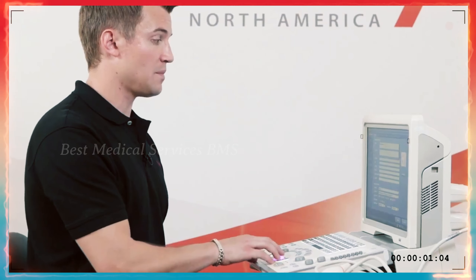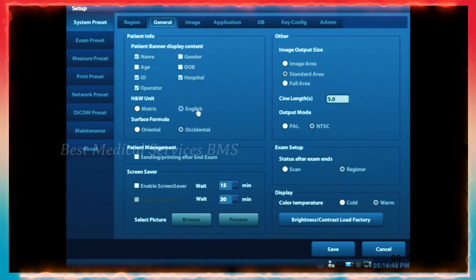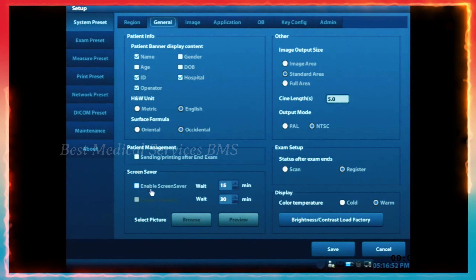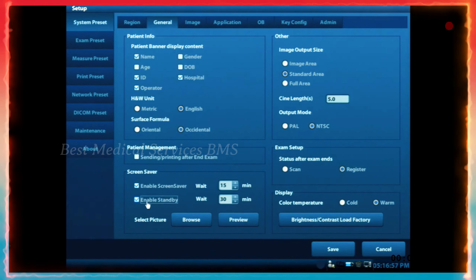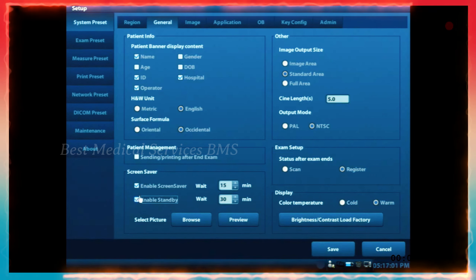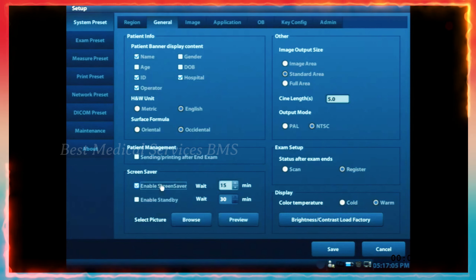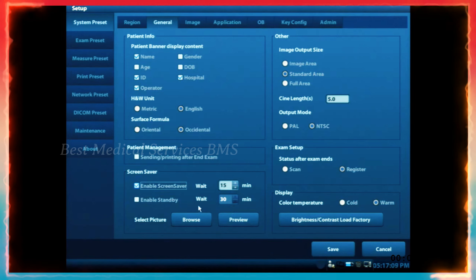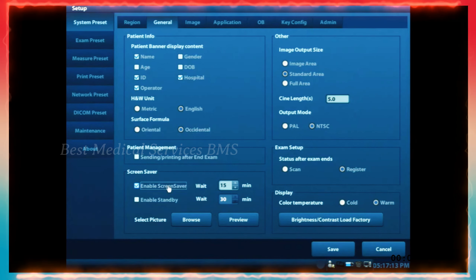Another tab to look at is the general tab. You'll see that the screen saver and standby are selected by default when you get your machine. If you don't want those, you can uncheck them and also change the duration for how long it takes for the standby and screen saver to come on. Depending on where you are and what you prefer, you can have those selected or deselected.